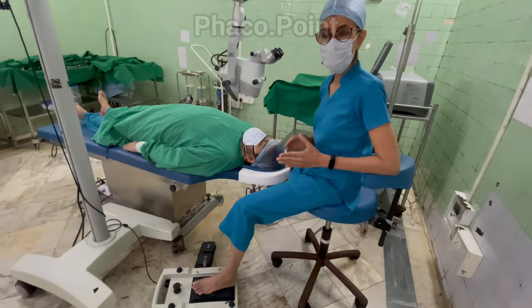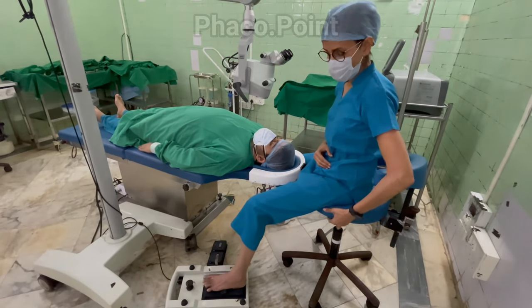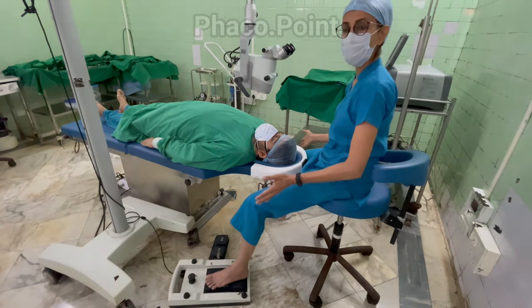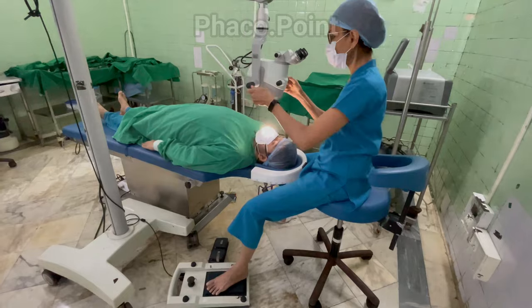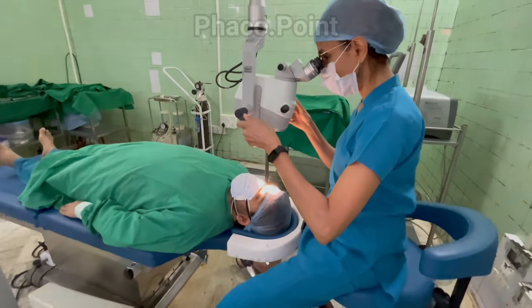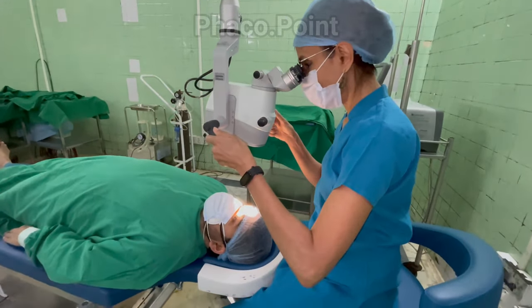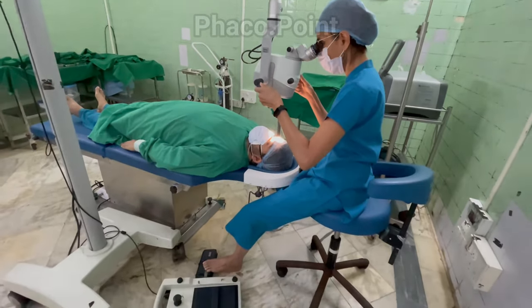The setup sequence we follow is: first, adjust the chair height to get optimal positioning of the foot on both foot pedals; second, position the microscope at the correct height for comfortable viewing by the surgeon with minimum strain; and finally, adjust the table height so as to get a perfect focus on the patient's eye.